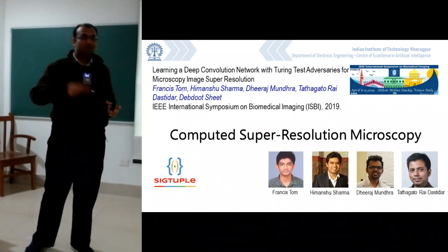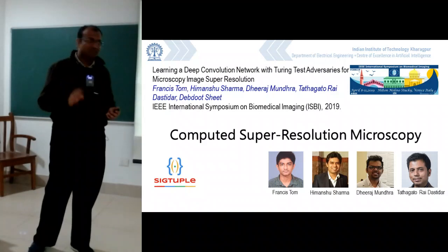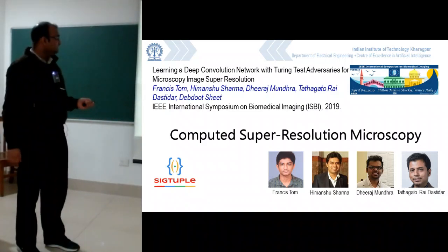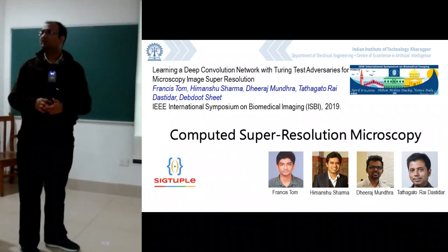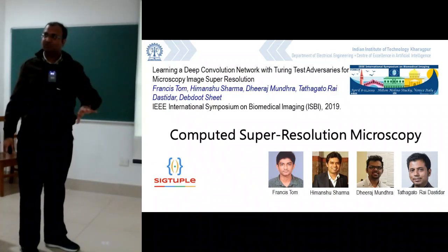So now my imaging process becomes faster. The only trade-off which I had is I lost out the resolution. So that's something which I will now have to compensate. So this super resolution, a computational way of super resolution essentially, was brought in order to do that. So we could now deliver a product which for the company works very fast.